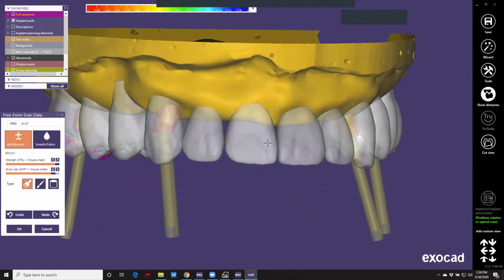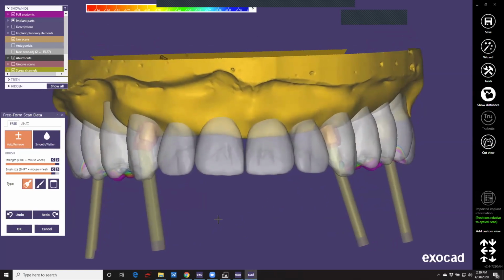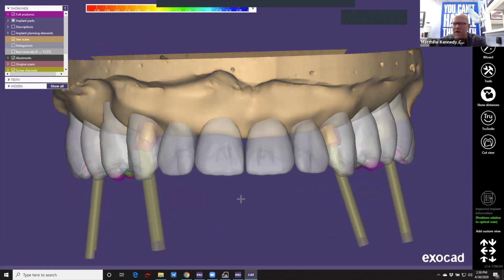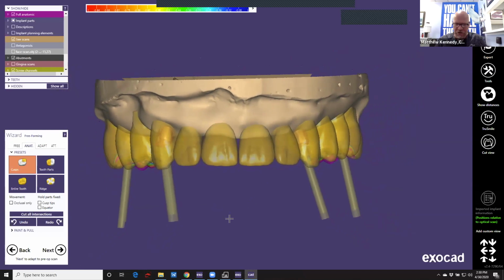And Matt, while you're getting that going, we had a quick question here from the audience of what was the face scanner that was used. So that was the DOF Snap face scanner, and you use it in conjunction with the DOF Freedom UHD, the ultra high definition desktop scanner. Correct. And I can tell you, I've tried a lot of face scanners. The benefit of the Snap scan is alignment to as close to real as possible, because it uses a bite registration in the patient's mouth, and then that is scanned in accordance to your model work. That really ensures that your alignment is what it is.